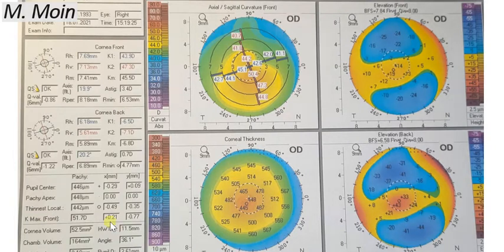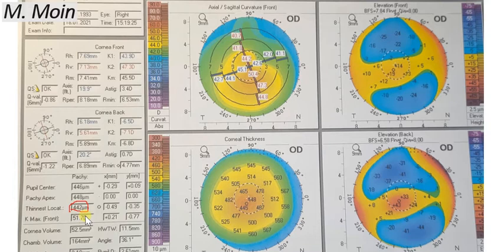On the right eye topography, the first parameter to assess is Kmax — a value above 48 is suggestive of keratoconus, and here it is 51.7. Next, look at the pachymetry at the thinnest location: it is 442 microns, well below the normal of 550. Also assess the displacement of the thinnest point from the x- and y-axes: it is minus 0.49 and plus 0.35, indicating how far inferiorly and laterally the cone apex has shifted.